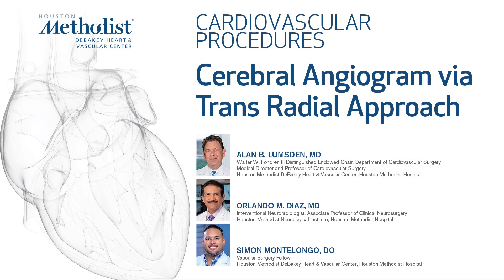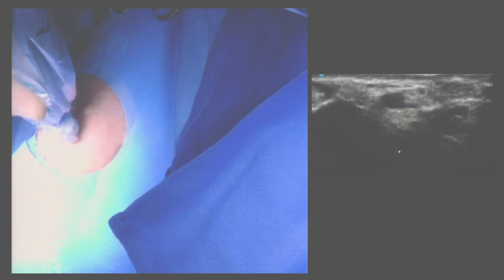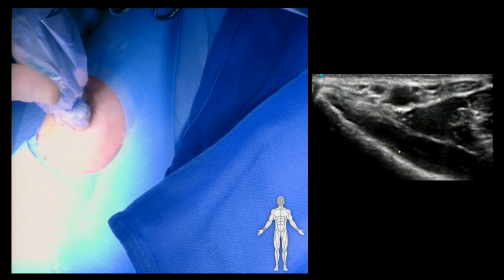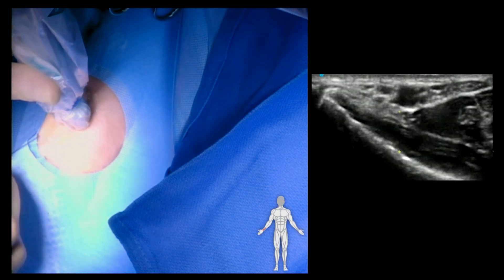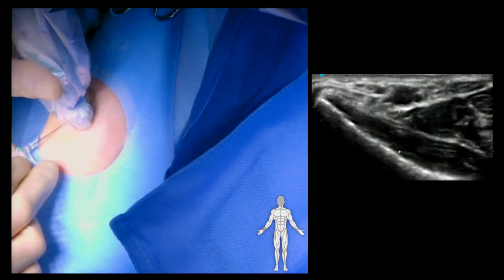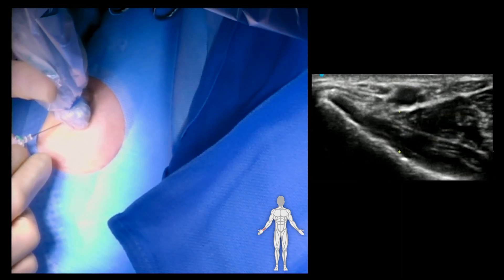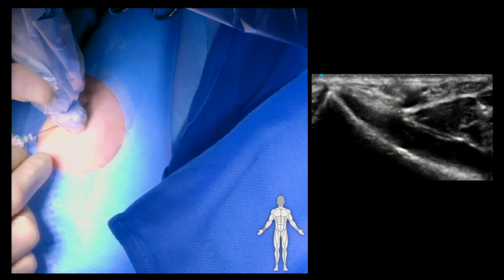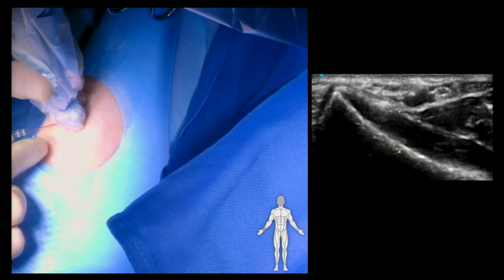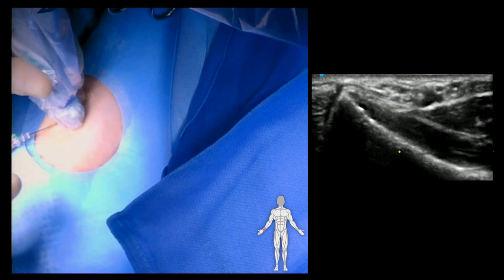In this video we're going to demonstrate how to do a four-vessel cerebral angiogram via a transradial approach. We'll skip through the transradial access so you can see radial artery cross section. We use a standard radial artery access kit with a radial artery cocktail to prevent vasospasm. In this case, this is the right wrist that we're approaching through.